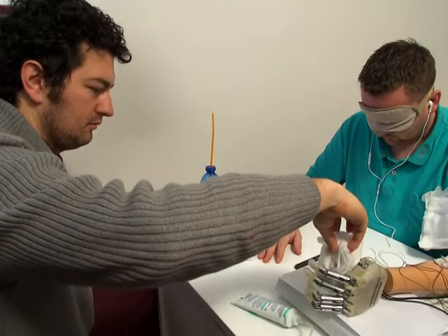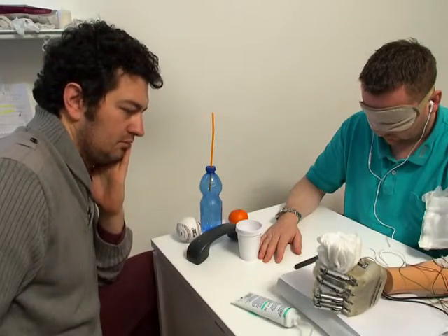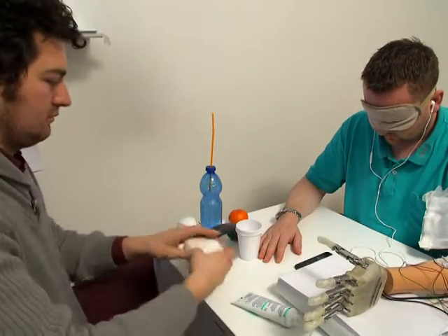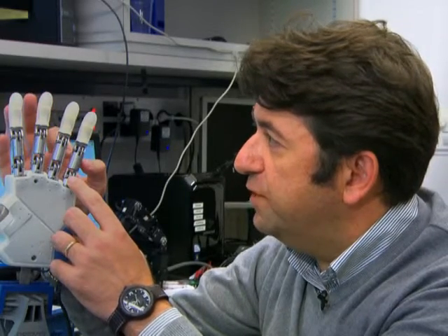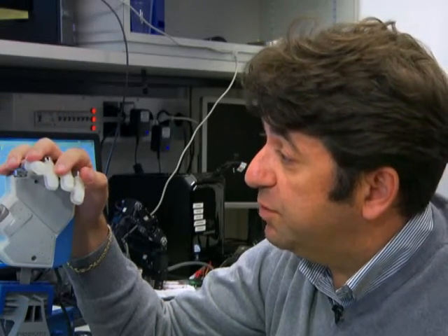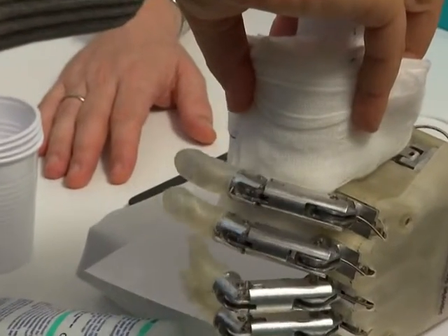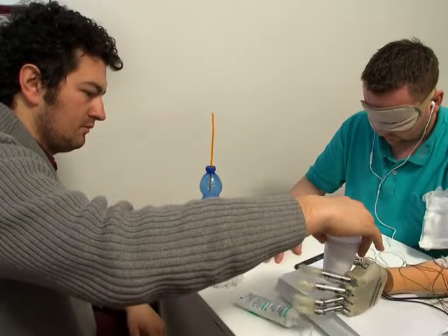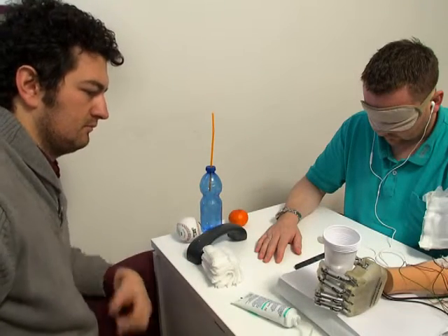For the first time we were able to restore a real-time sensory feeling in an amputee while he was controlling this sensorized hand. The hand has several sensors attached to each tendon of each finger, and we can use these sensors to understand the level of force the patient was performing while grasping an object. We use this force information to deliver very precise stimulation to the different sensory nerves in order to restore this real-time sensory feeling into the nervous system.